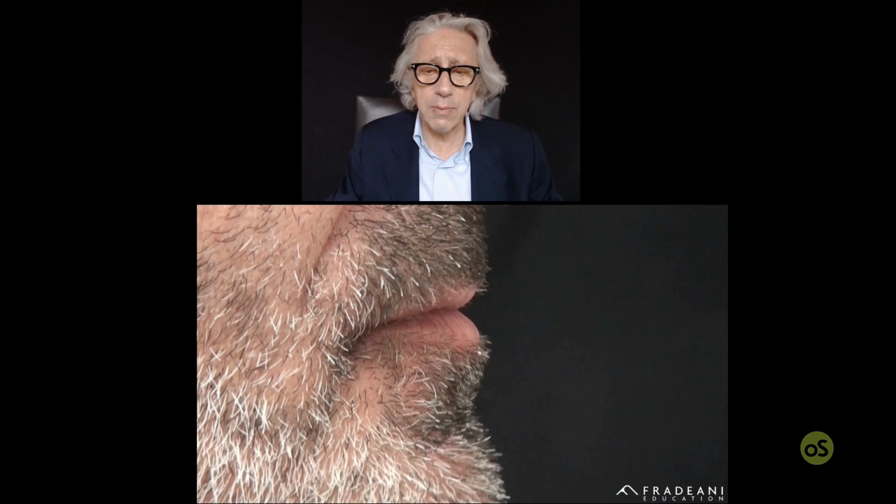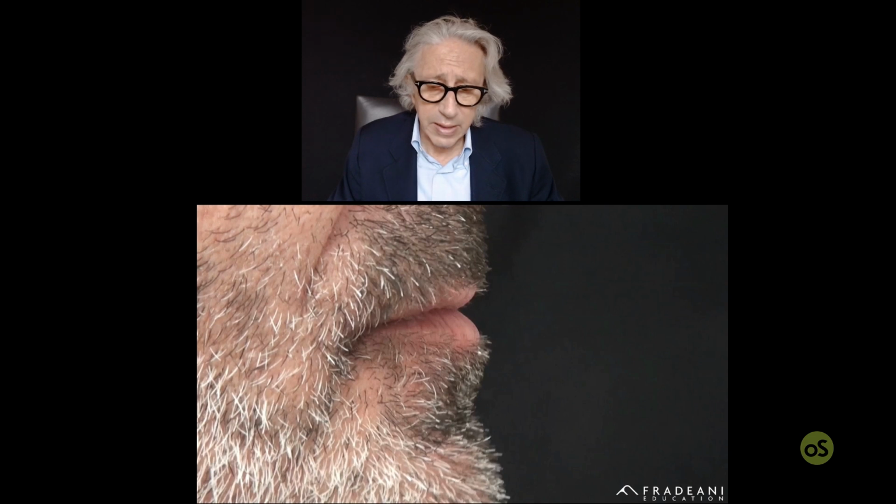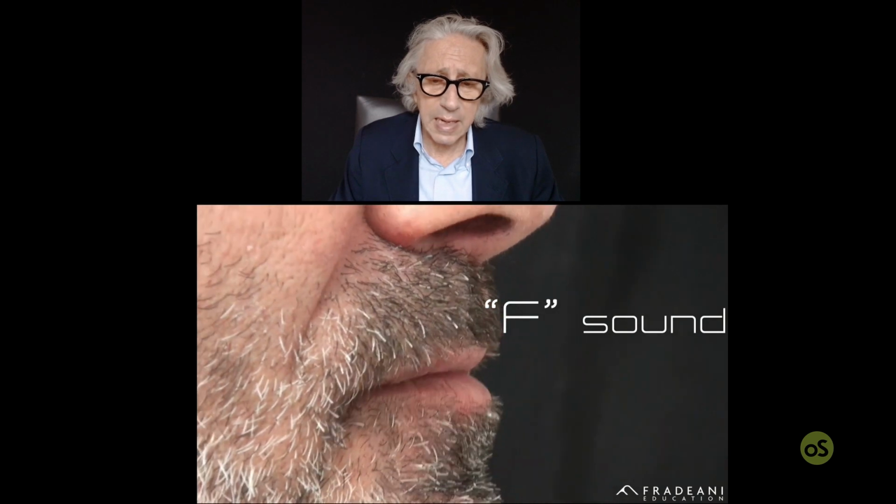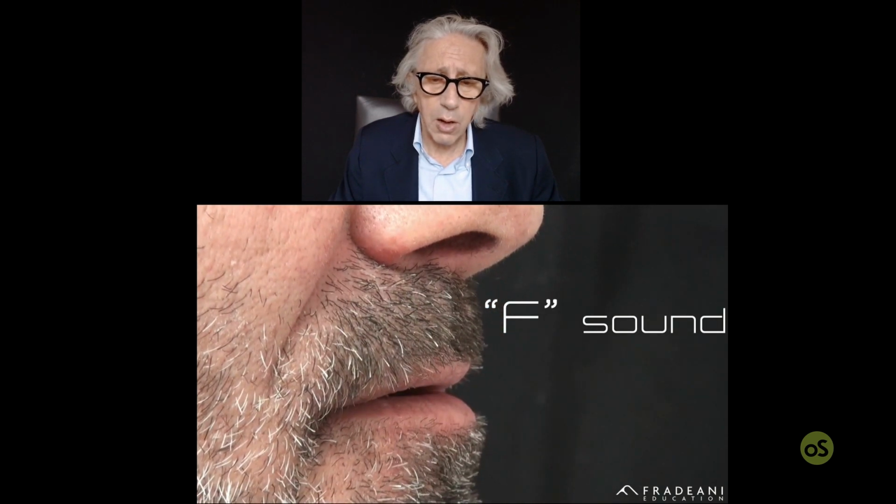So let me start with some phonetic tests. We have seen already the importance of the phonetic tests, like the F sound, the S sound, and the E sound, to determine the position of the incisal edge. Let me start with the F sound. The patient seems to be really internally located. The incisal edge is far away from the vermilion, on the wet part of the lower lip line. So theoretically, if we needed to put the teeth more out, that would be very possible. So we can minimize the preparation aggressiveness because we have to add volume externally, buccally.